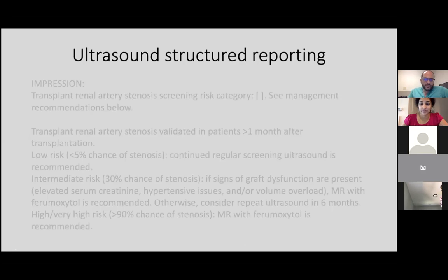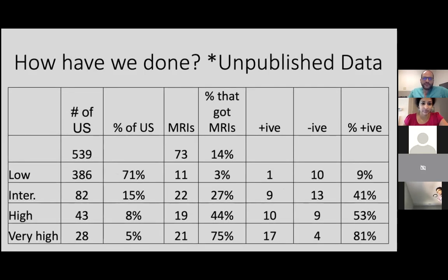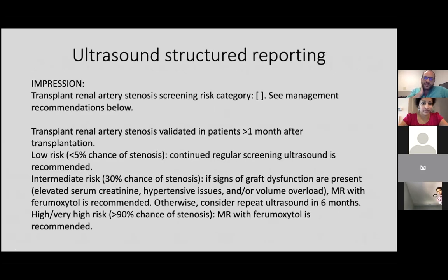Okay, so that's our ultrasound structured reporting. It's based off of somewhat flawed data, because the way that we were able to figure out which ultrasound findings were important was from a pre-screened population. It was individuals who had undergone angiography, so these were patients who were probably pretty high risk to begin with.